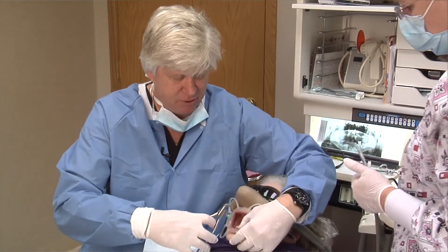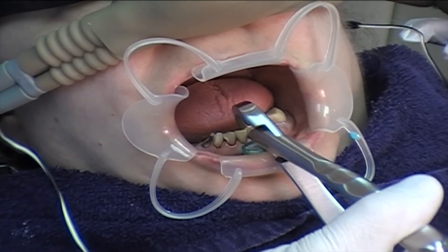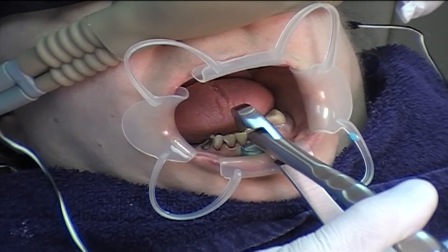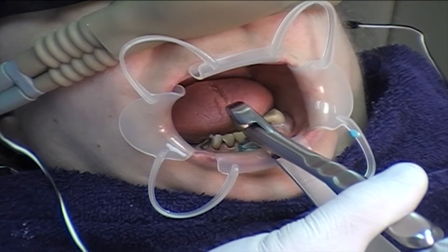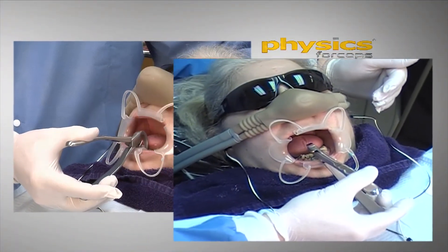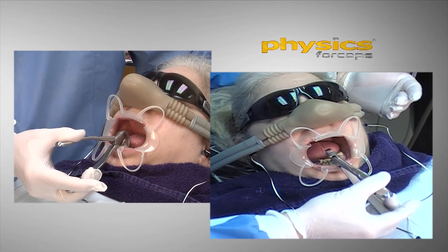Let's do an anterior one to demonstrate. Our patient knows if anything I do bothers her, she's just going to raise her hand. I have the beak of the physics forcep engaged on the lingual surface of the root. I have the bumper engaged on the facial surface, deep into the vestibule. I'm holding this forcep with two fingers — a thumb and one finger — and this is just a leveraged finger. I'm simply rotating my wrist. No arm pressure at all. No bicep pressure at all.